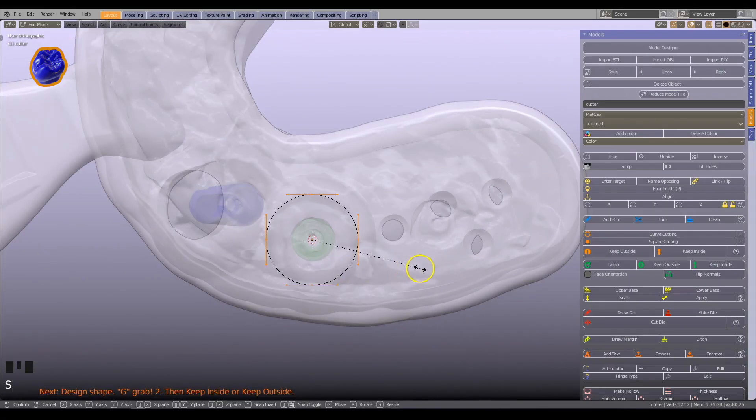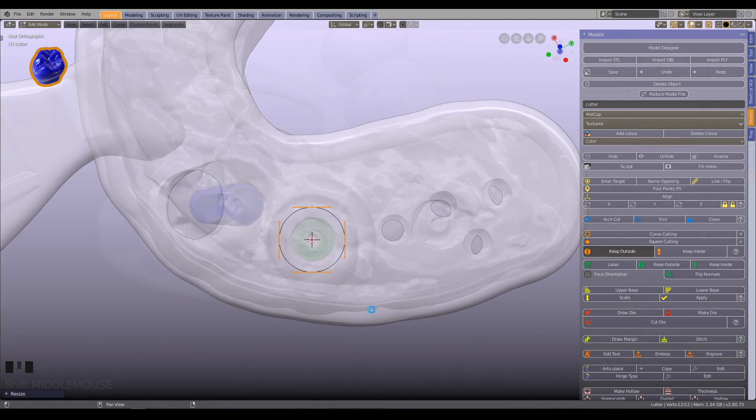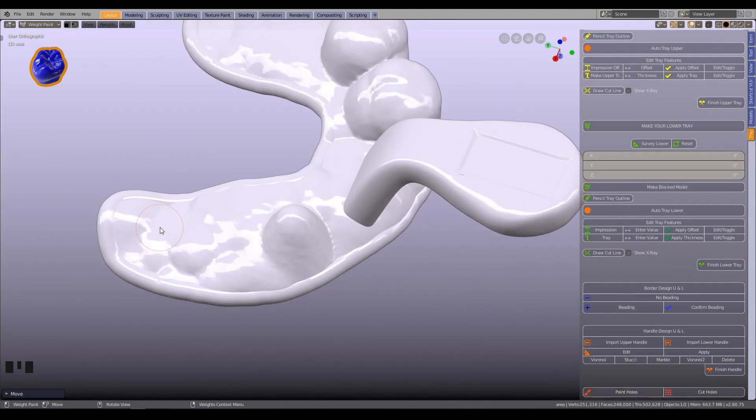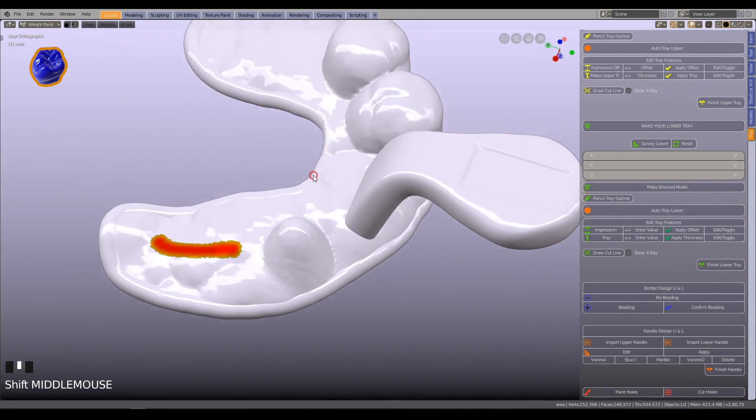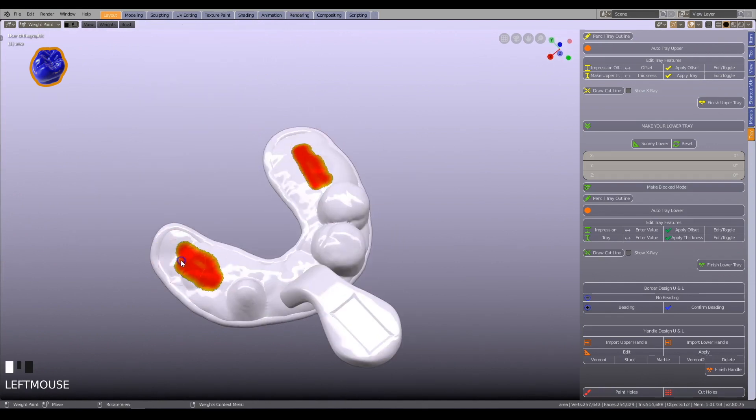Use the Model Designer module to cut holes where needed. Explore Blender 4 Dental's totally unique feature, paint on holes, to perforate your tray.